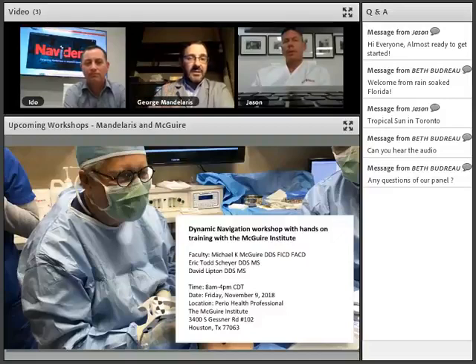Yep. Okay. So we have to be a little mindful of that, and that's where I think Luigi's study was really very valuable, because he showed as long as you use the technology and the accuracy inherent within it, and you place the implant, even manually, you're going to get a very, very accurate result, if not more accurate than using stereolithography. Yeah, as you mentioned, 0.12, 0.13 seemed to be the average difference when he guided the implant and when he didn't. And I know a lot of you are taught in dental school that the implant is sterile and not touching anything unless it comes out of the package, goes onto the tray, and then into the mouth. So we certainly don't advocate one or the other. It's a clinician's preference.